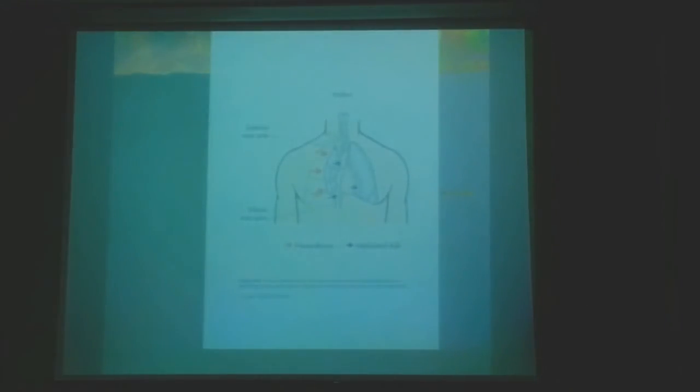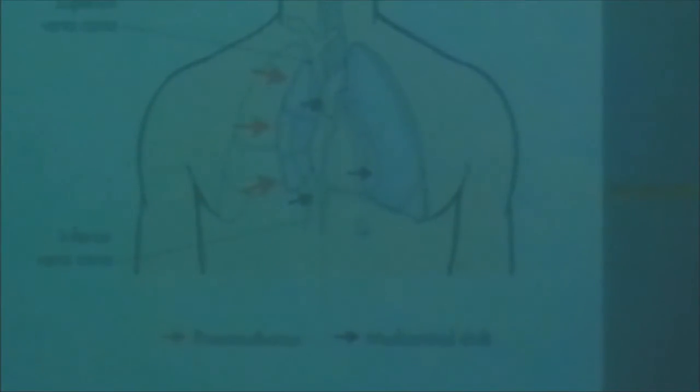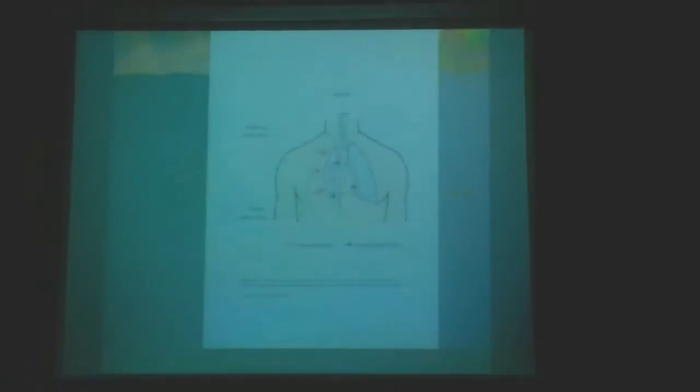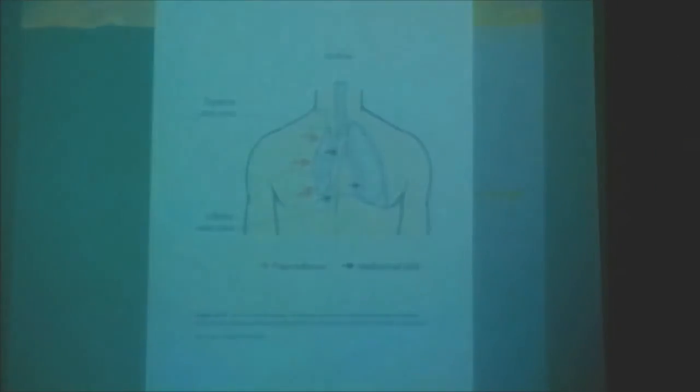Imagine that the lung is injured here. We give air, and the air will come out of the lung, right? Where is that? The air will come out from here. Suppose the ventilator gives the same tidal volume. It will not take it. Why? The air will not come back inside the chest again. It's one way only. One way valve.